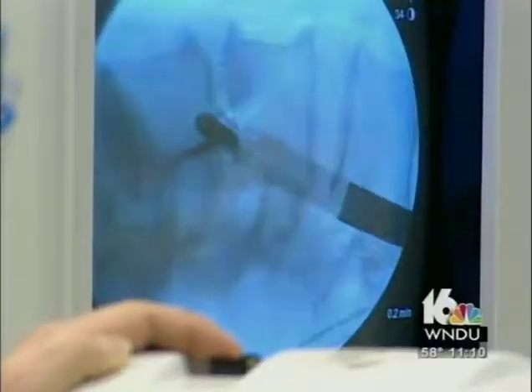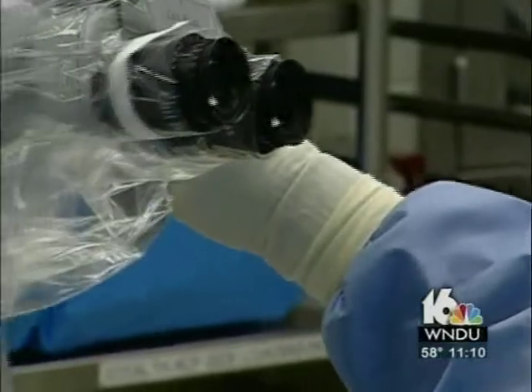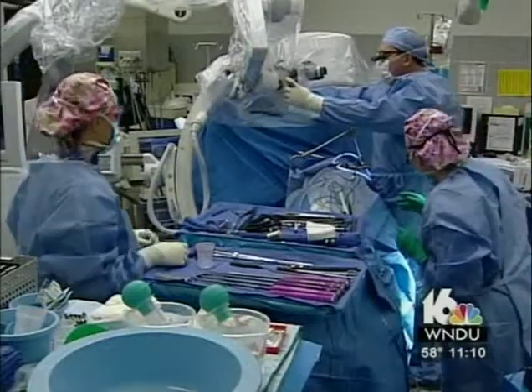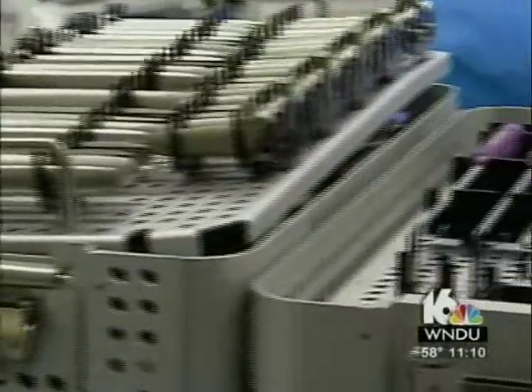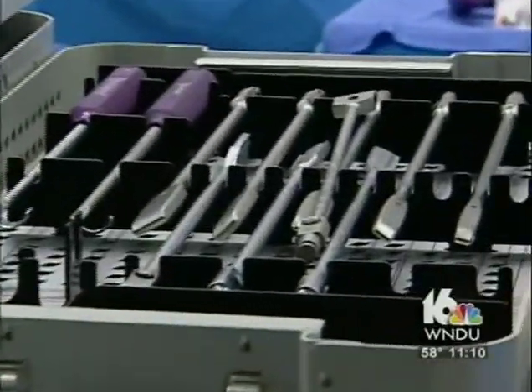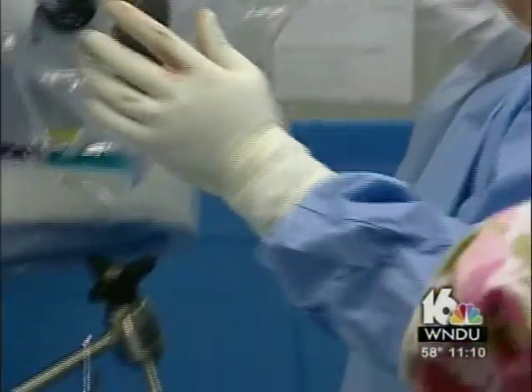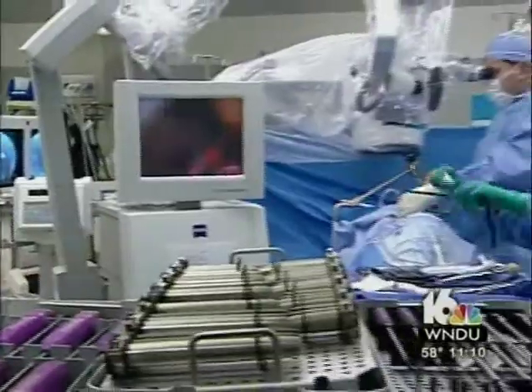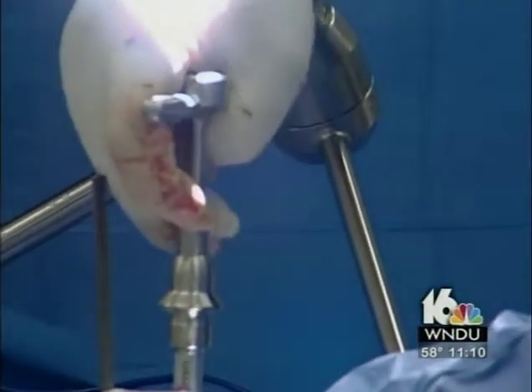X-ray, X-ray. Finding the spot he's looking for. Beautiful. A massive camera is brought in so Dr. Mango can get a better look at the disc. And now it's time for this surgeon to use his tools on a patient who has worked machinery all his life. When you look down here now, this needle is right in the disc, and this white glistening stuff that you're looking at here is the disc space itself. If George were awake, he might be surprised by the mechanics that go into removing his bad disc.